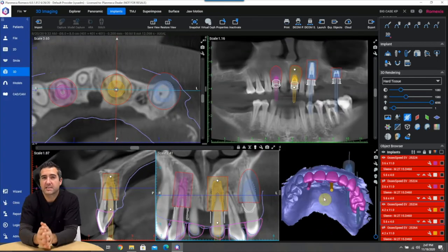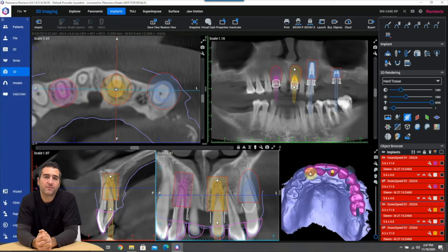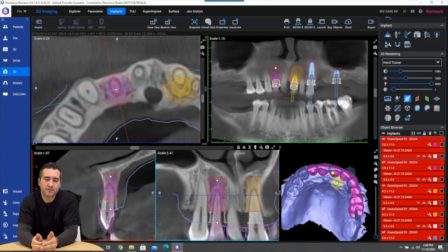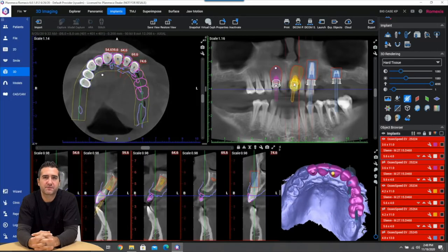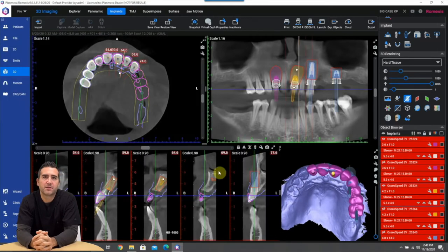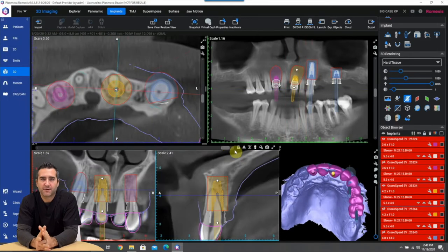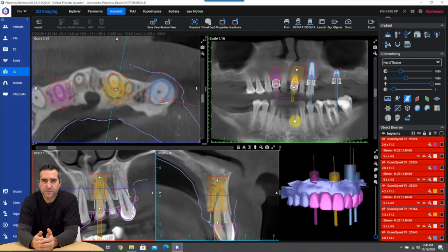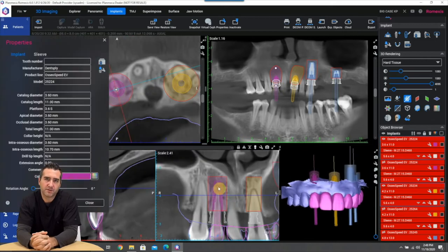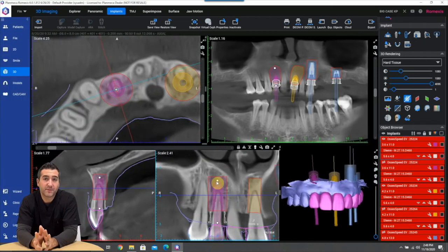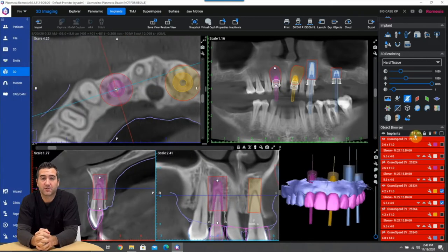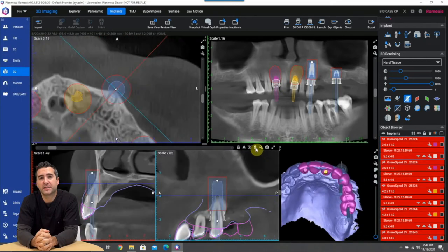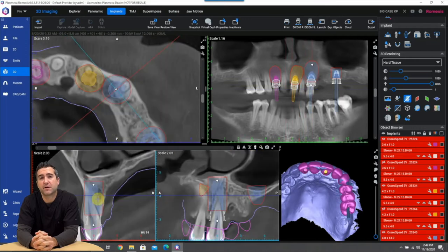In this case, Astra phenomenal implant but you have to do some mathematics for the sleeve height. You have to know the total drill length and you have to move the sleeve manually to the appropriate depth depending on the size of the implant that you're placing so you have to have that all figured out.